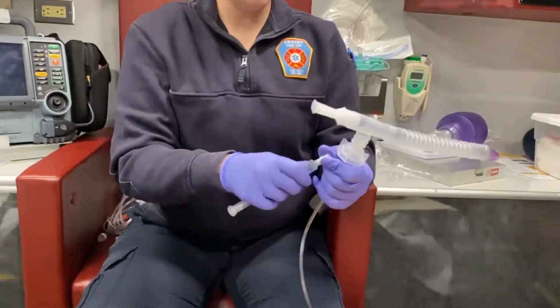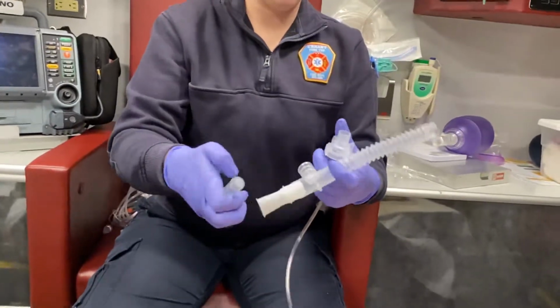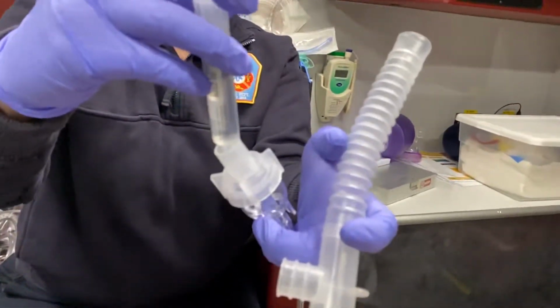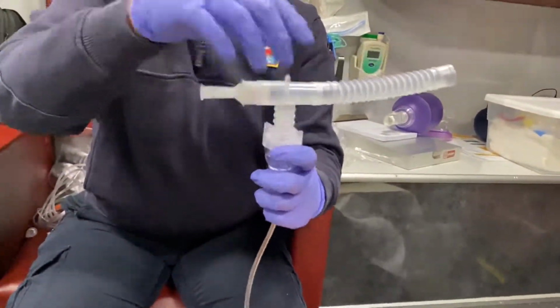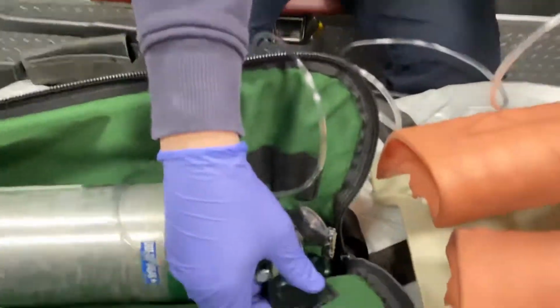So when we're ready for our medication, I just take this T piece off the top and I squirt my medication down. You just want to make sure you're squirting it down the side, not essentially down that blue piece in the middle. Put your connector back on top, and we're going to set our flow meter from 6 to 8 liters for this.